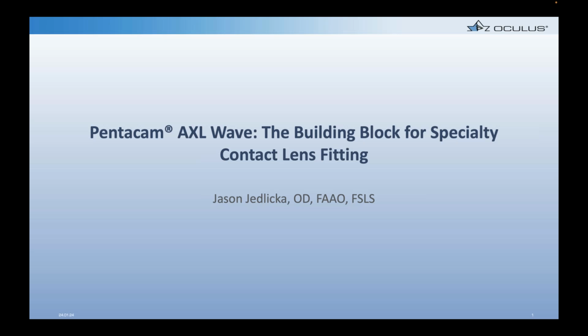And good evening, everybody, and welcome to the Oculus Clinical Webinar Series. I'm Dr. Bill Tullo, Medical Director at Oculus. Tonight, I'm really pleased to welcome a good friend, Dr. Jason Jedlicka. He's going to talk tonight about the Pentacam AXL Wave, the building block for specialty contact lens fitting.